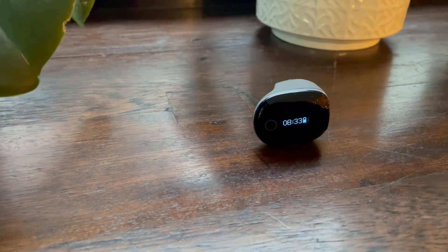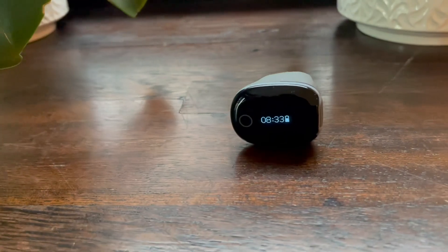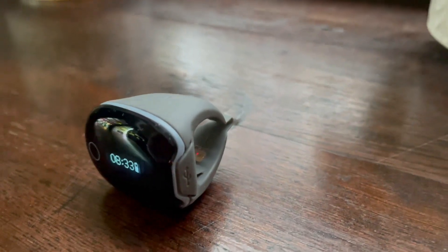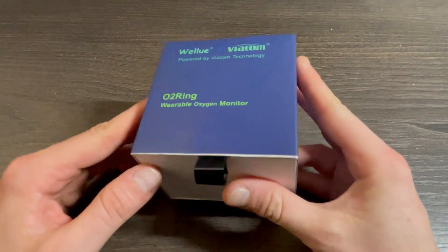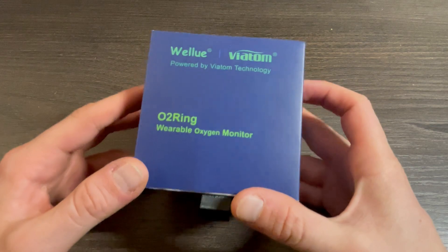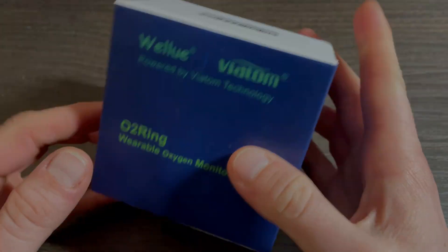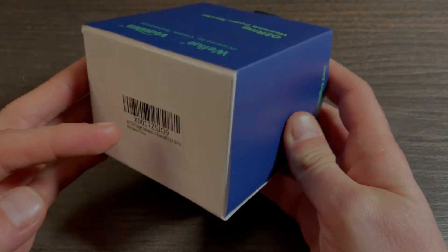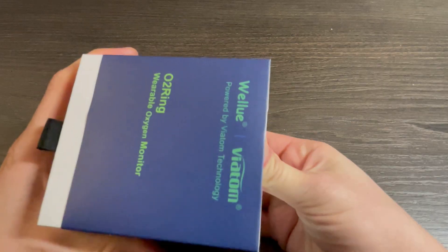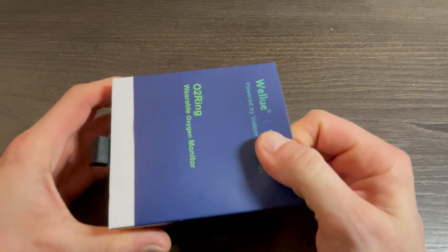There is a lot to show and tell about this minimalistic device, so without further ado let's get into it. We'll start with unboxing the ring, cover the design and ergonomics, then get into the features and functions. We'll also show you how to use the ring, how to get maximum benefit from the app, and how to export data to other devices including your PC.